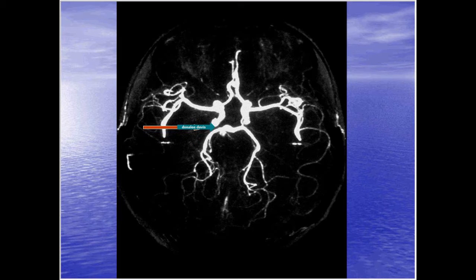Now, did this happen because this patient was in that automobile accident a couple of years ago? You know, were they hit in the head? No, this patient was born with this. They would have probably never known they didn't have a PCOM. They just happened to have a history of migraines, and we did an MR angiography on her. Okay, so you're born with these. This isn't something that just occurs because of trauma or what have you.